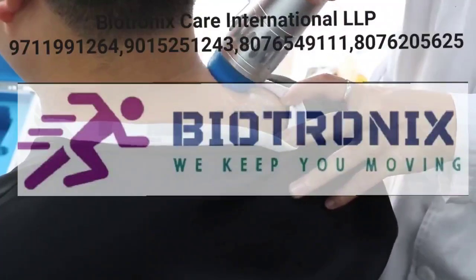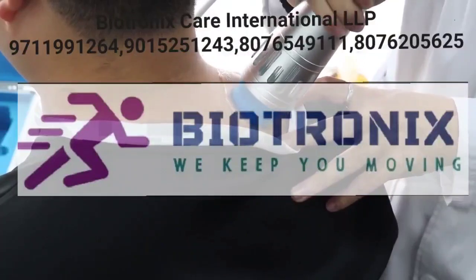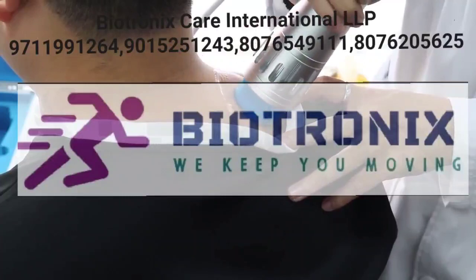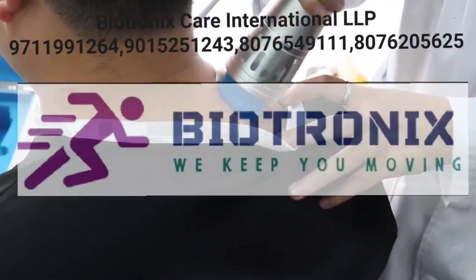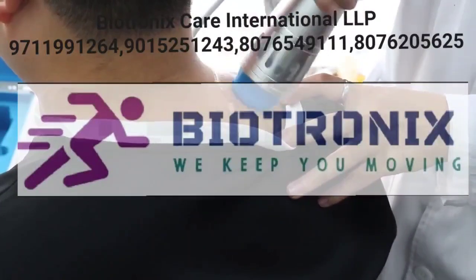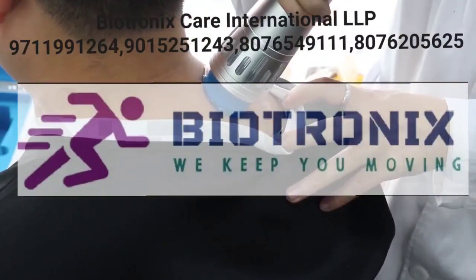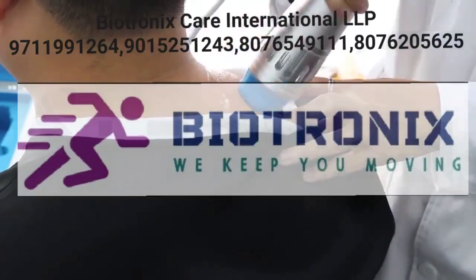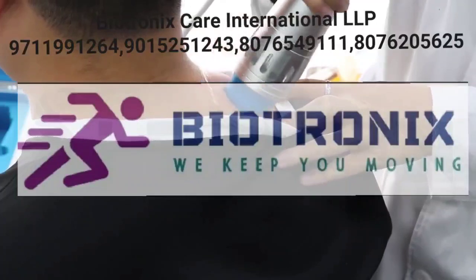And this is rotate. This is a rotate way to do the treatment on body, and this is the point treatment.